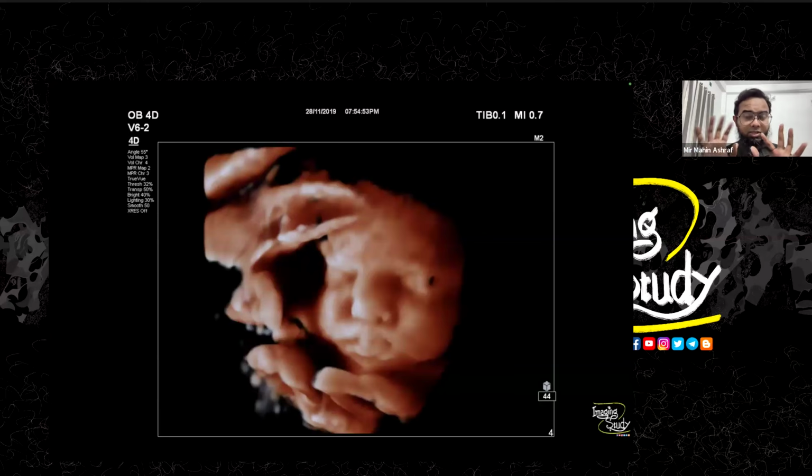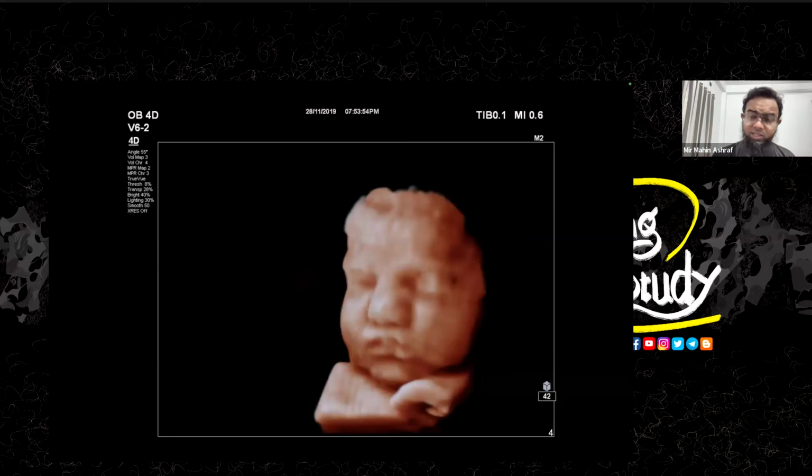Now, this is the whole process you have to go through to get this picture. But always remember that you should never get satisfied with what you get. You always have to go further. So I'm not satisfied with this facial image. I have tried to edit a little more, and now the picture comes like this. So you have to be patient and work very hard. You have to know your machine to get a good picture.